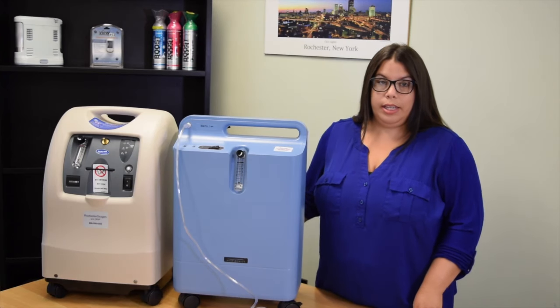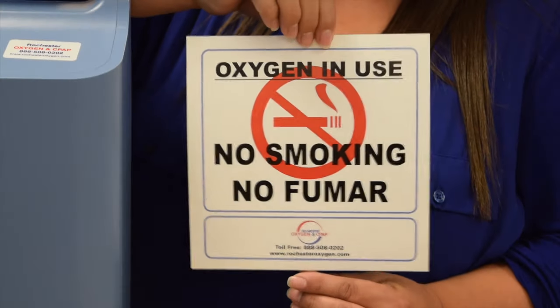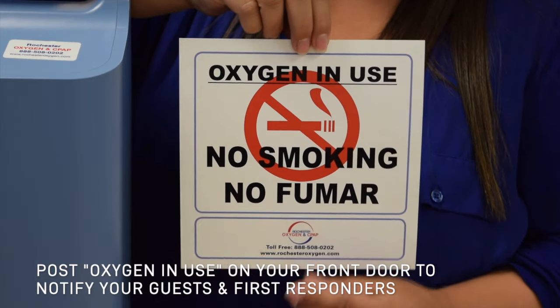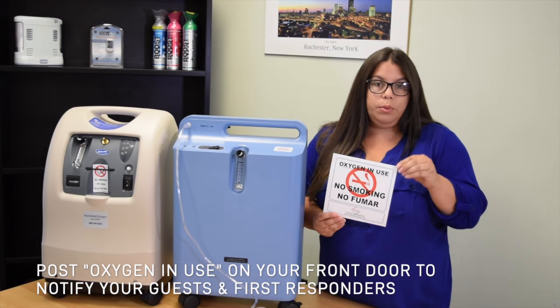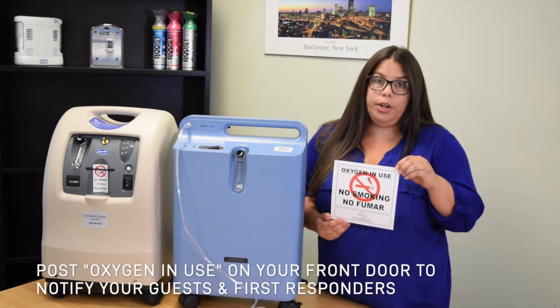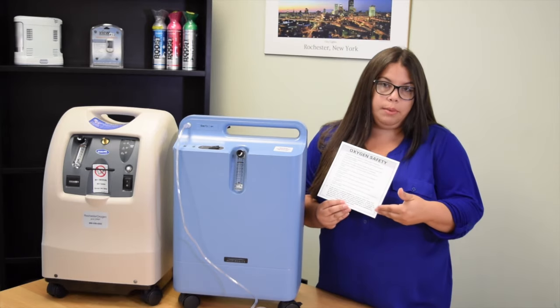Now for some fire safety tips. In your setup folder you will receive a sign which you want to post on your front door to let your guests know that there is oxygen within the home. You always want to maintain six feet of distance from any open flame while wearing your oxygen. On the back there are some extra safety tips as well.